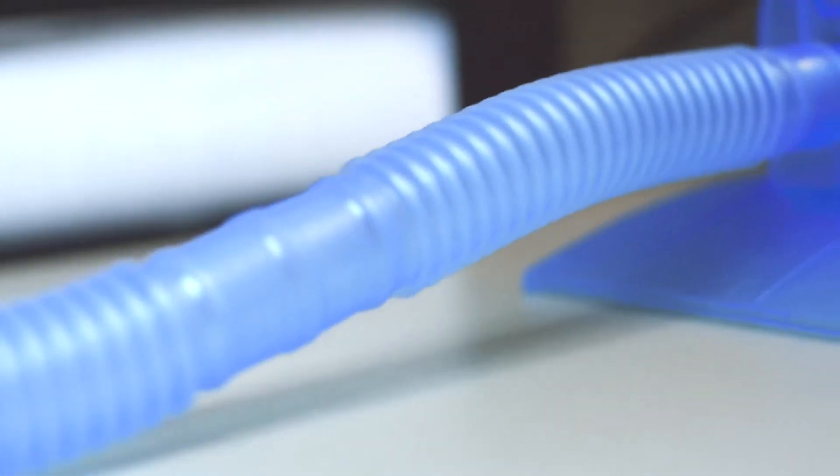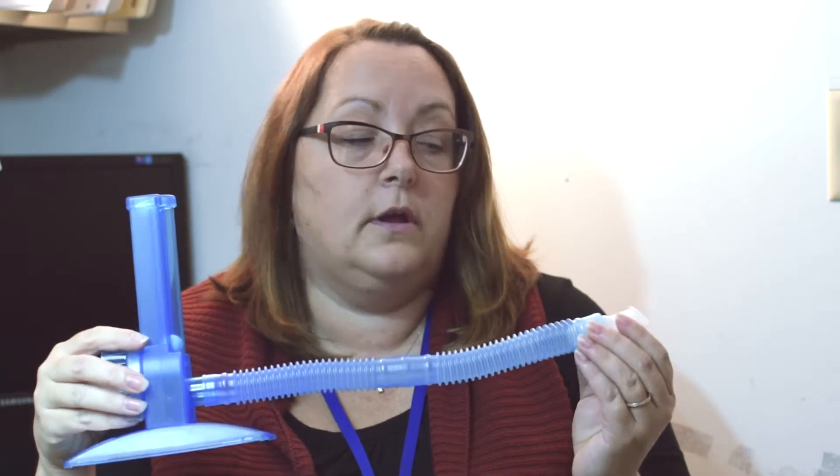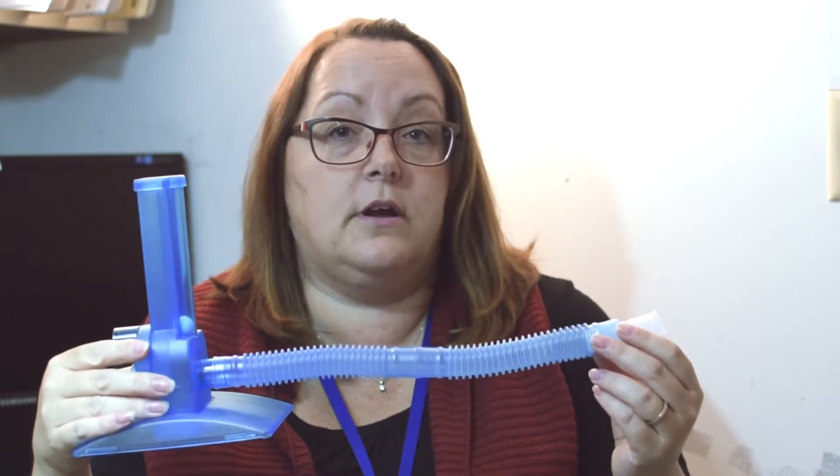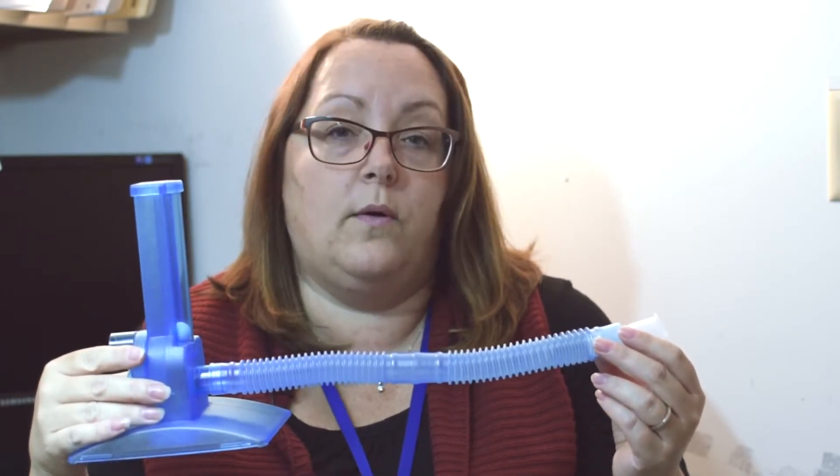This is the mouthpiece of the incentive spirometer. You will put your lips around the mouthpiece and keep it closed. You will breathe out, exhale, and then when you breathe in there will be a ball that will rise inside this chamber. Your goal is to hold the ball to the top of this chamber for a three-second count and then breathe back out normally. We ask that you repeat these exercises ten times every one to two hours.